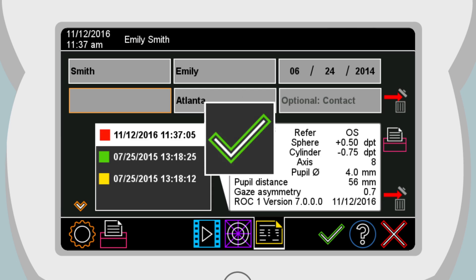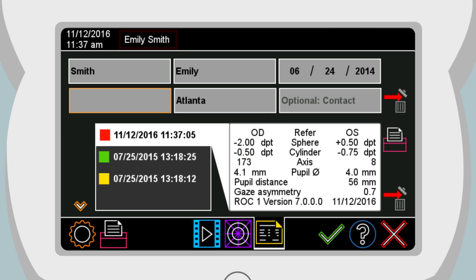A symbol with a green checkmark confirms that a measurement report has been saved on the USB stick and a print job is sent via the infrared interface. The entered patient data has been assigned to the measurement results and is displayed in the title bar.